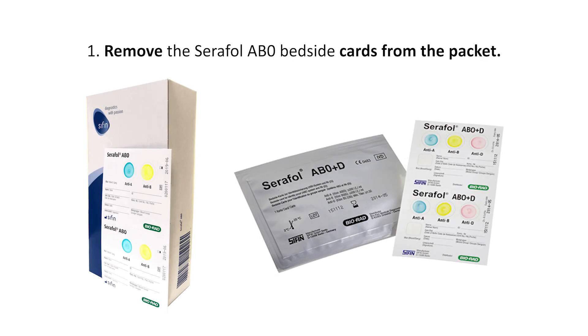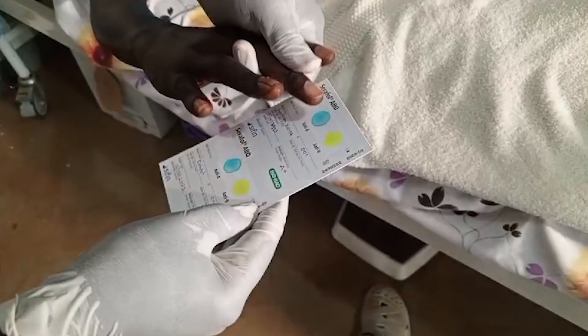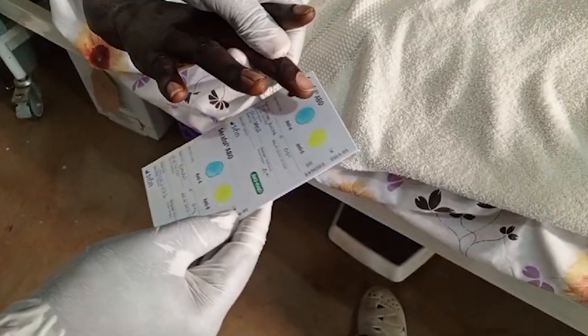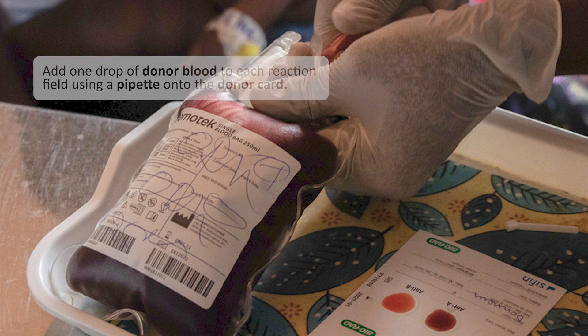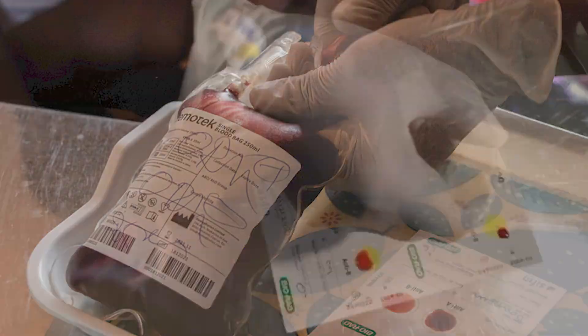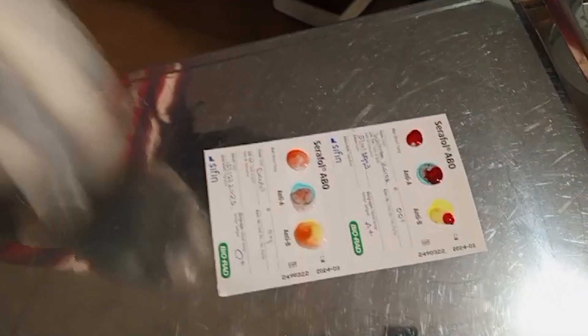First, remove the Serifol ABO bedside card from the packet. Fill in the card with the recipient and donor information according to card instructions. Add one drop of recipient blood to each reaction field using a pipette or directly from the finger of the recipient onto the recipient card. Next, on the donor card, add one drop of donor blood to each reaction field. Using a pipette, add one drop of isotonic saline solution or water to each of the fields on the cards.